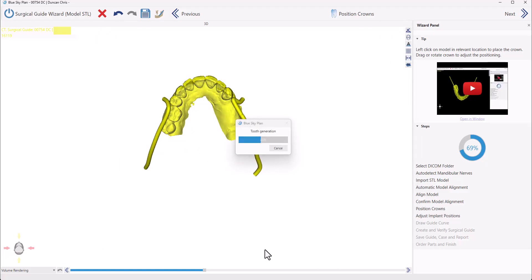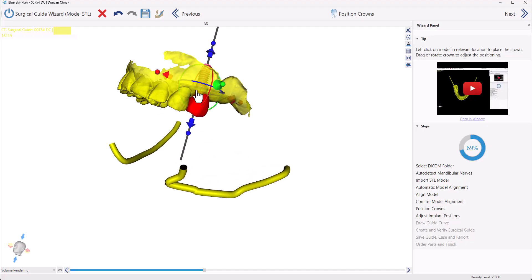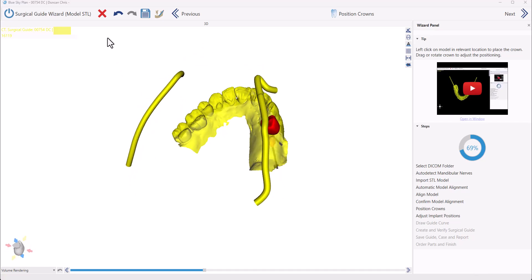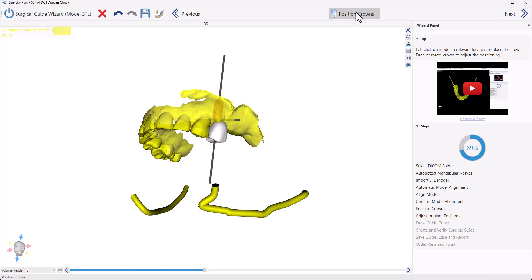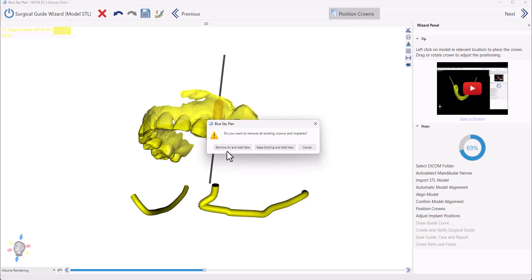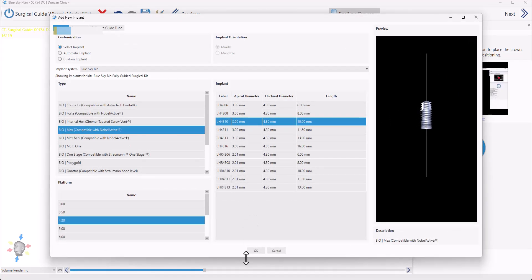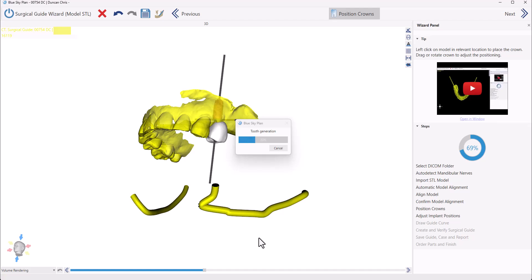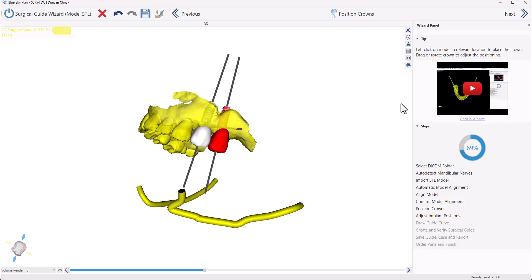The software is now automatically designing an AI generated tooth and will place the implant along with the tooth. We could use our left mouse button to rotate and we could see the tooth has been placed along with the implant. Since this is a two-implant case, we're going to click Position Crowns. The software is asking if we want to remove what we have or keep existing and add new — we're going to click Keep Existing and Add New. Select the relevant tooth, select the relevant implants, and click OK. The software is now automatically generating the AI tooth and placing the implant. We could see our AI generated teeth and implants placed, and now we're going to click Next.